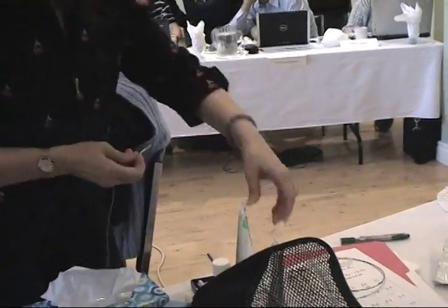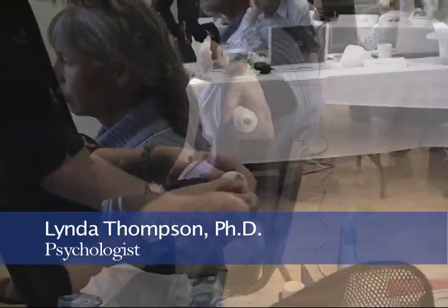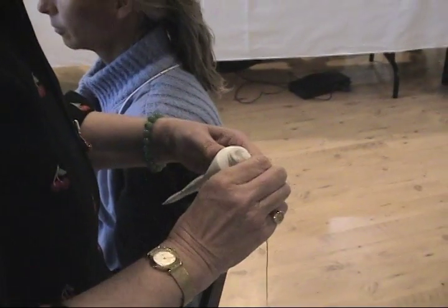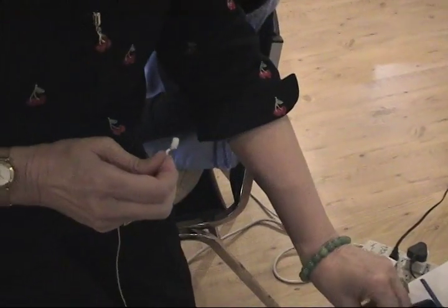These are flat electrodes and we use these just because they're easier to clean. So you put a generous dollop of this 1020 gel onto your electrode.